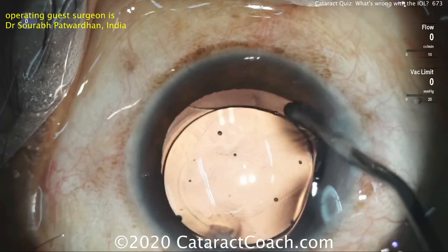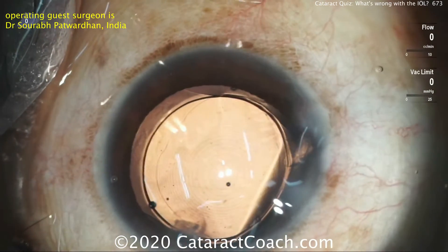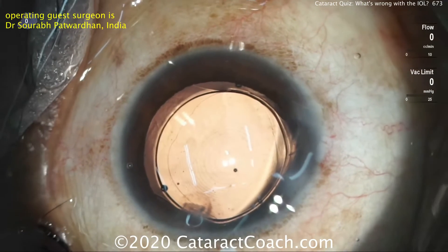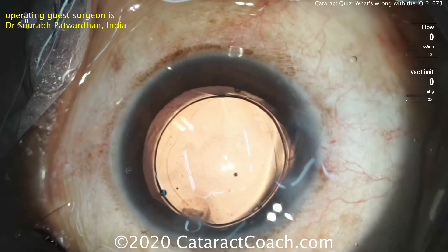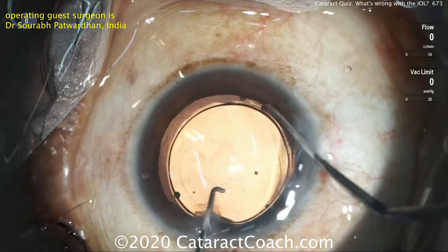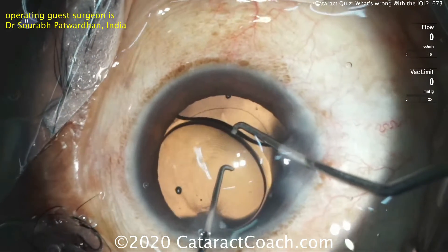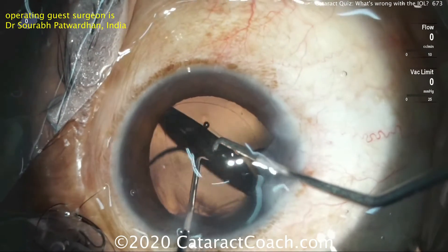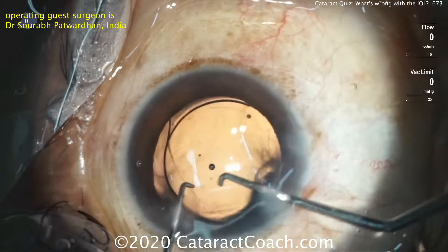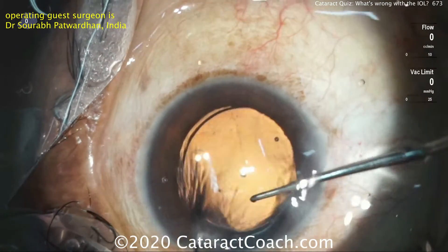Expanding the capsular bag is a key technique here. You have to protect the posterior capsule, and the more you expand it, the more room you give yourself. Dr. Sareb has a beautiful technique for flipping the IOL inside the eye — he is a master. Using two instruments, lifting one edge of the IOL with the right hand, then the left hand pushes and brings the IOL around. And now it's completely flipped over. Fortunately, this lens is relatively soft and pliable, and the surgeon can do this all within the eye.